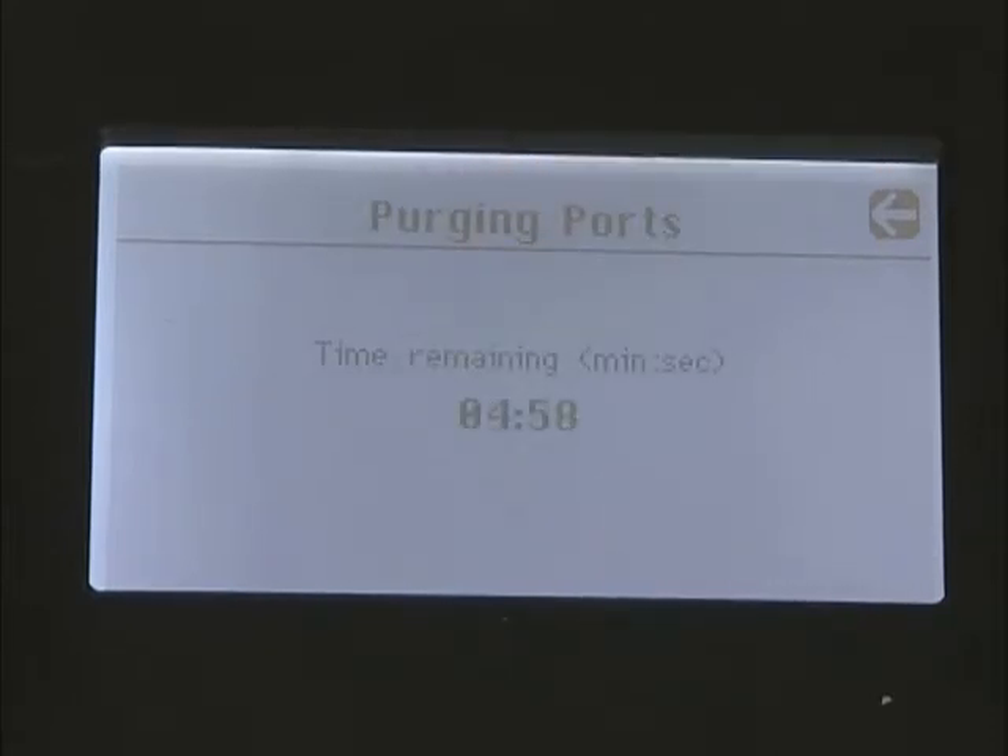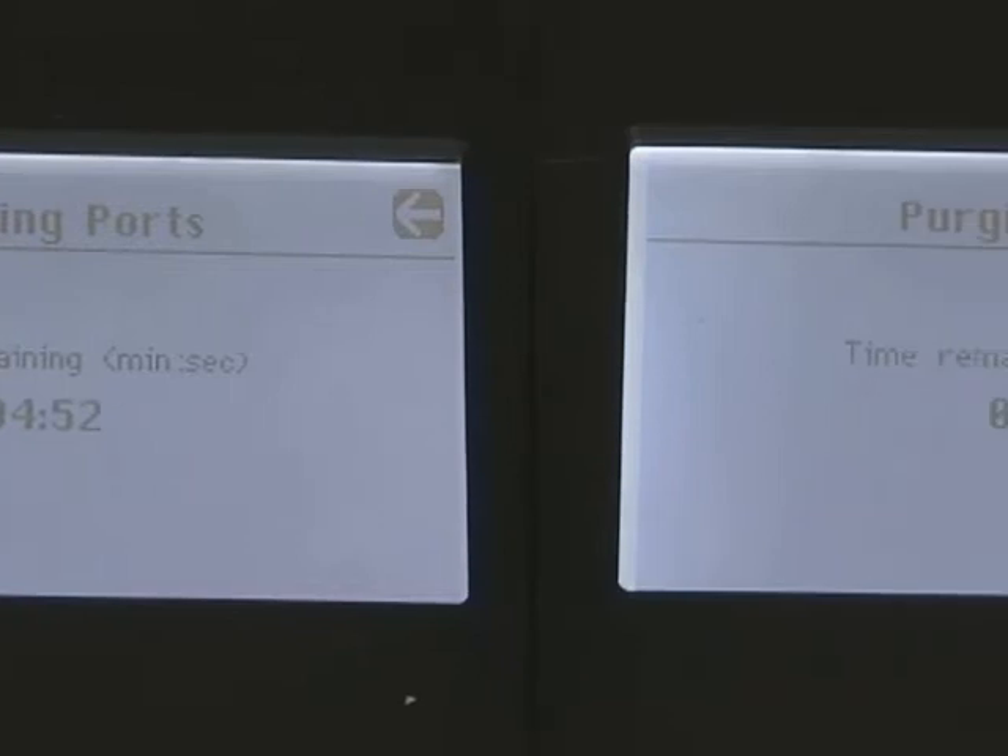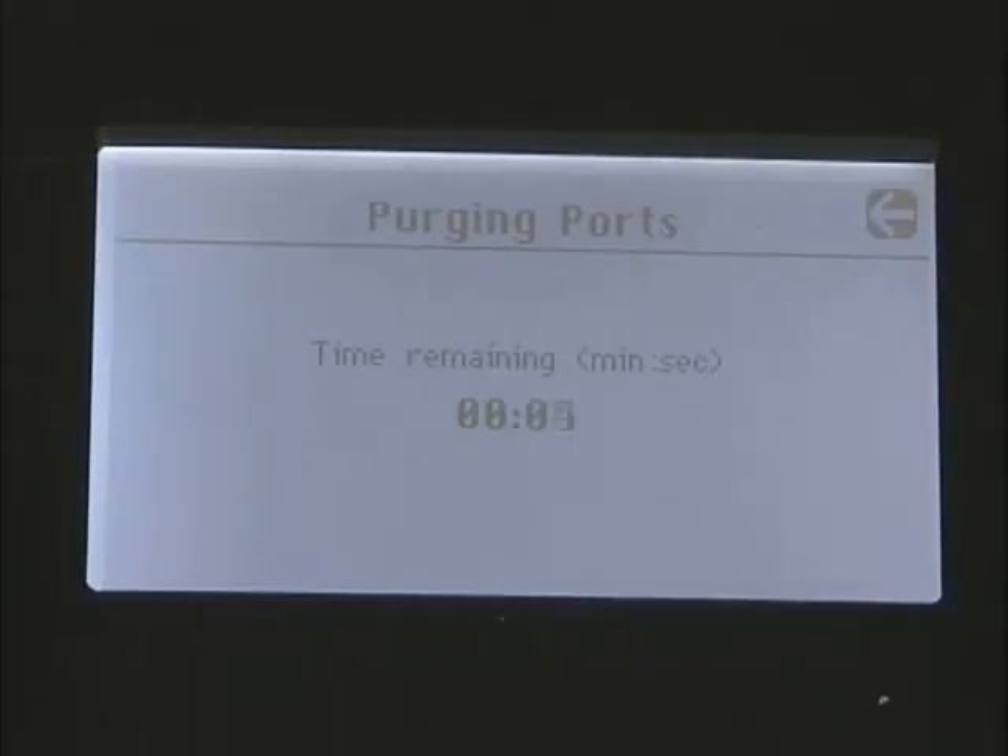The unit will now commence a five-minute purge sequence, during which time an airflow will be passed through all four ports. This clears contaminants from previous tests and ensures that a representative sample is being tested.